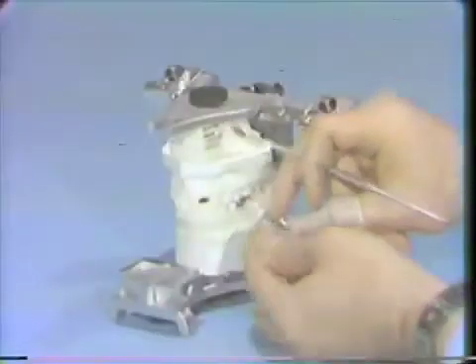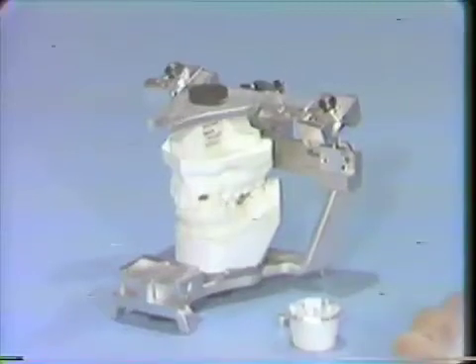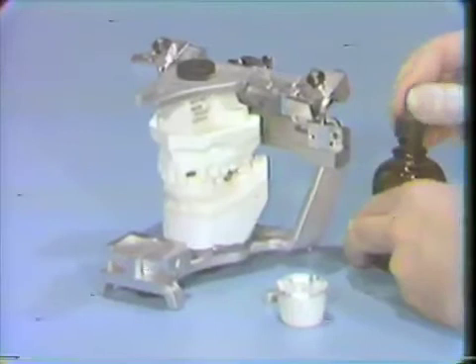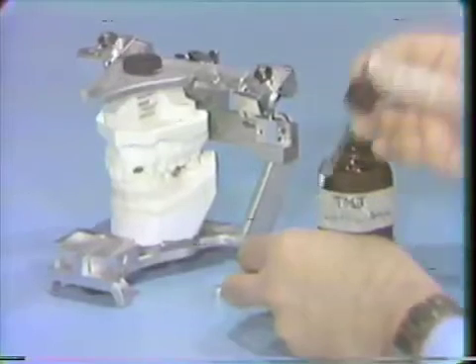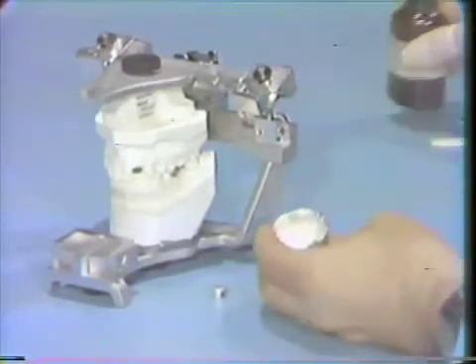So we will now mix up a bit of cold cure acrylic, and the type is not too critical. We could use Duralay or any of the other materials that are available for techniques similar to this. In this particular instance, we're using a material called TMJ acrylic.